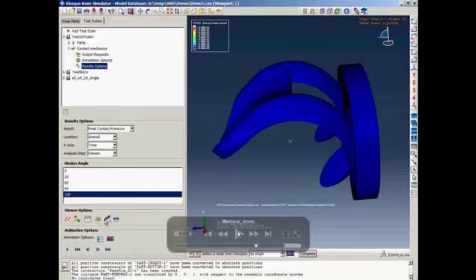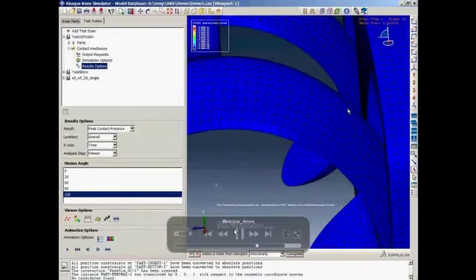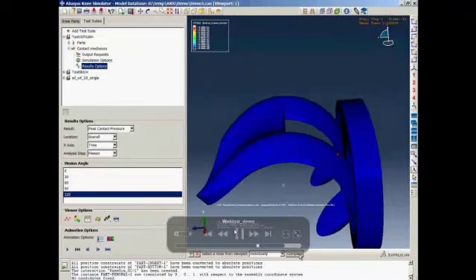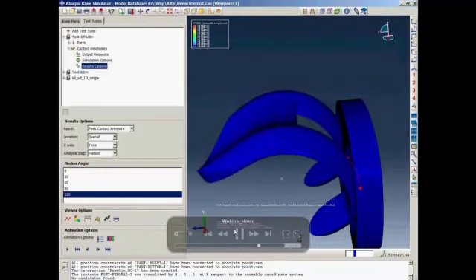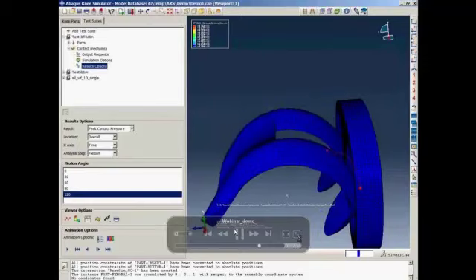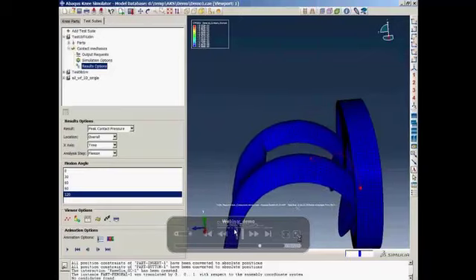It's called plot the trajectory. So the user can pick any point, any moving point on the implant components or on any ligaments or bone parts. They can pick any points here, and the knee simulator will plot the trajectory of this point during the analysis. So in this case, I picked a point close to the dwell point on the femur components, and the Abaqus knee simulator plotted out how this node moved over the flexion range specified.